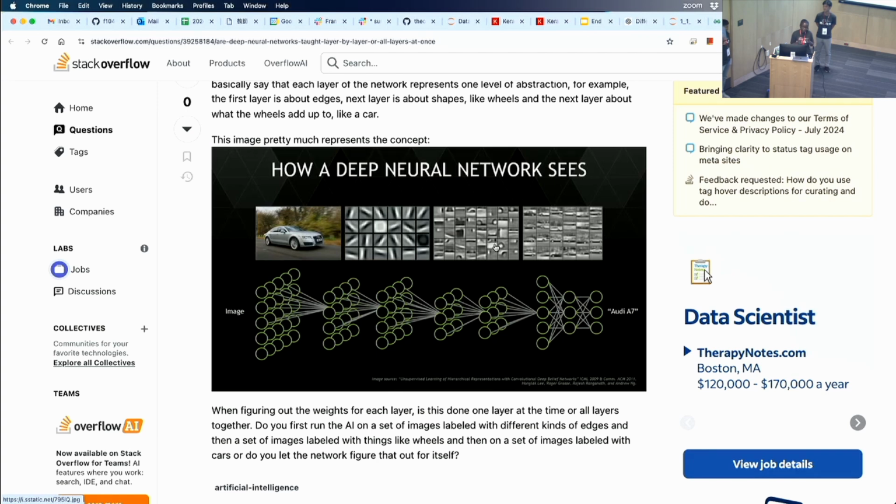So don't get so lost in the weeds. I just want you to get at least what the pipeline is, and why is it different from medical imaging? So Pochi, go ahead.